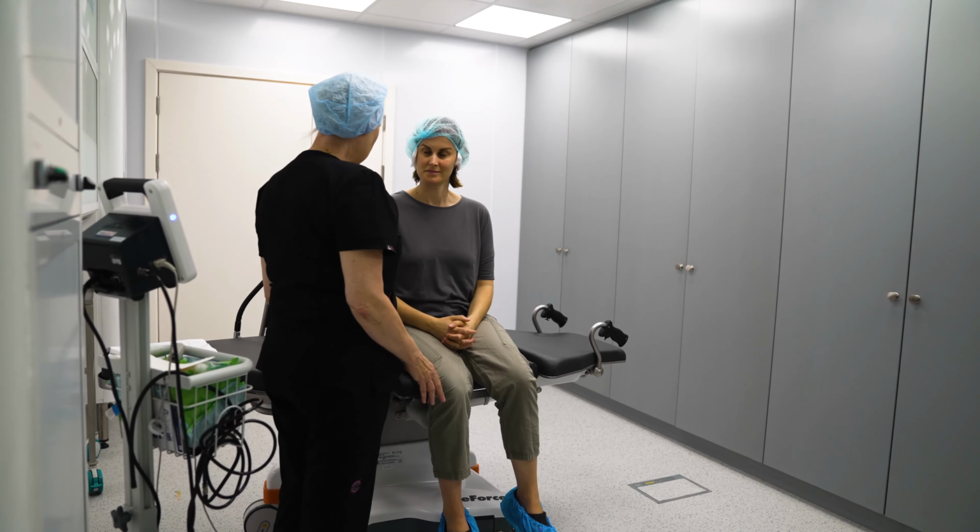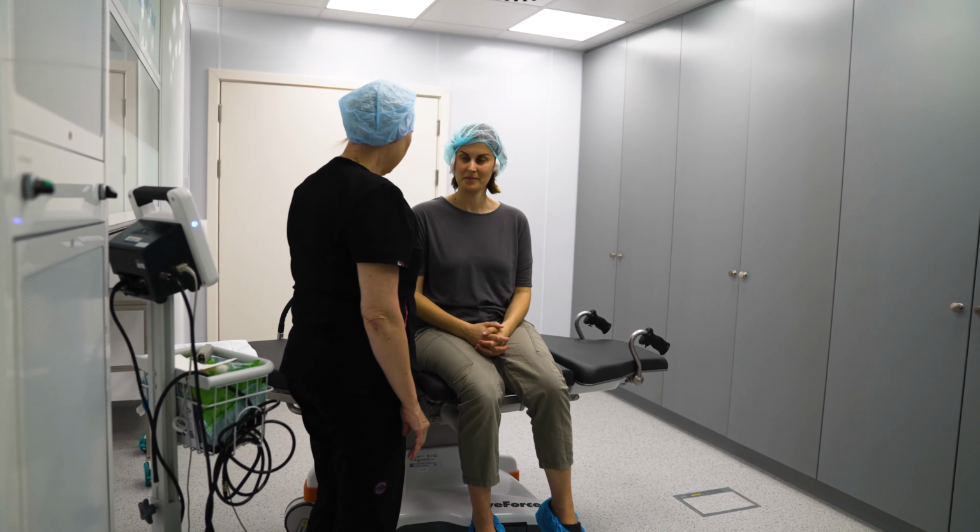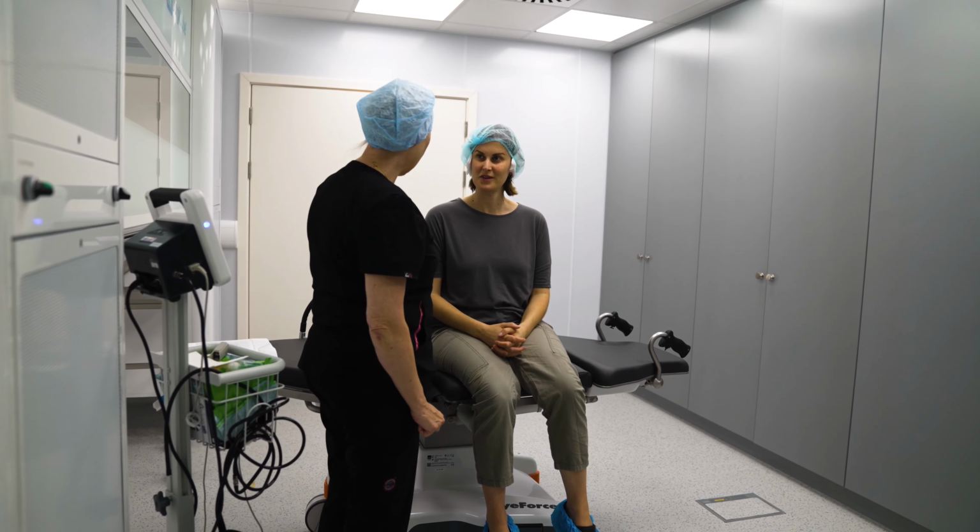The new lenses come completely folded and ready to go into your eye. They go in with a little injector. You may feel a little bit of pressure as the lens is going into your eye, but again, you won't have any pain. It's a very tiny incision in your eye, just millimeters. When the lens is put in, it's folded as it's going in, and then it opens up when it goes into the eye. Once the lens is in, sometimes you can see it like a kaleidoscope, sometimes not, because the eye is still dilated.